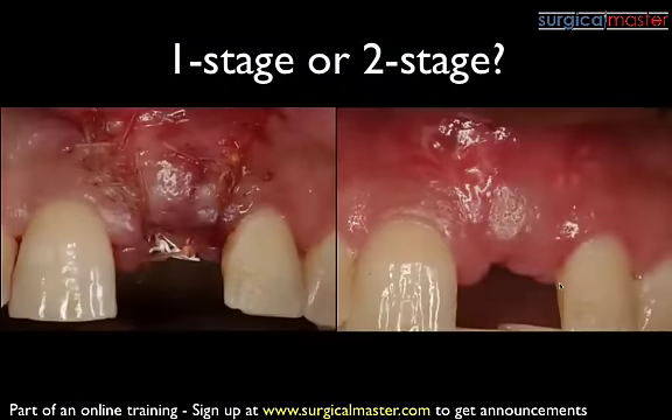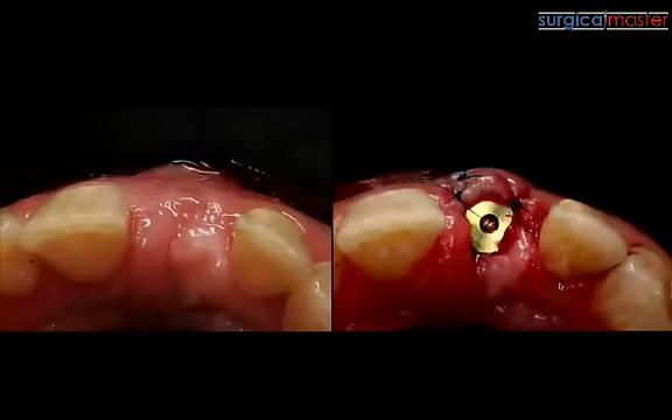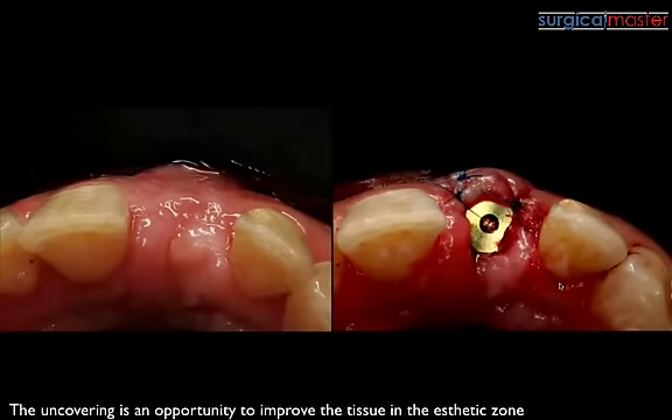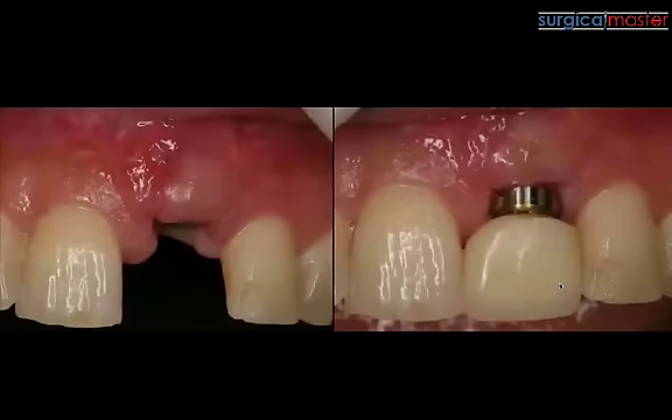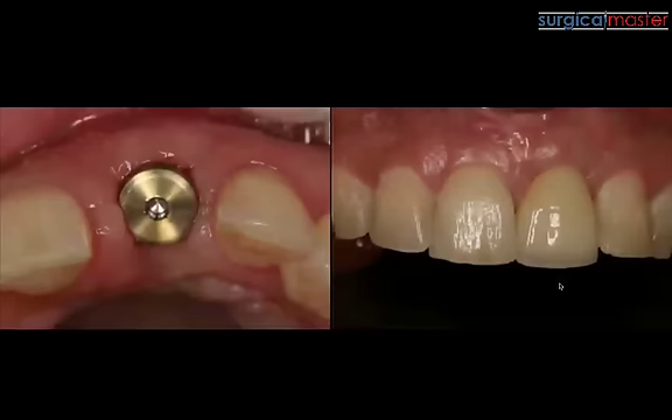You can make the decision to leave the implant exposed as a one-stage or a two-stage. A two-stage gives you another opportunity to augment the tissue at the uncovering, especially in the aesthetic zone — it's so critical. If you had some collapse of the ridge, we are always chasing our bone, always chasing our tissue. You can use an uncovering technique that starts more toward the palate with two vertical releasing incisions, expose the implant, sparing the papilla on both sides, and get a good outcome.